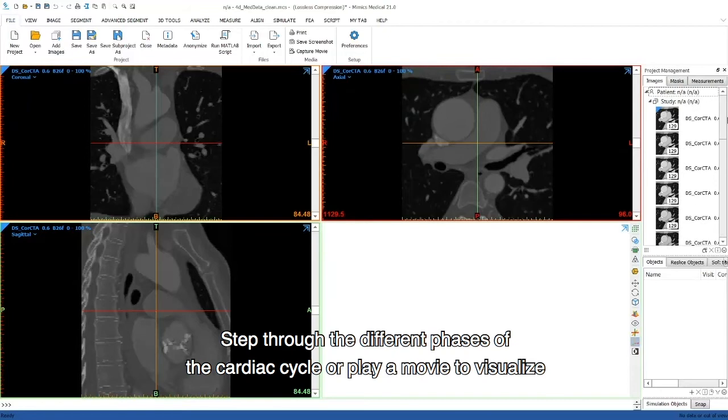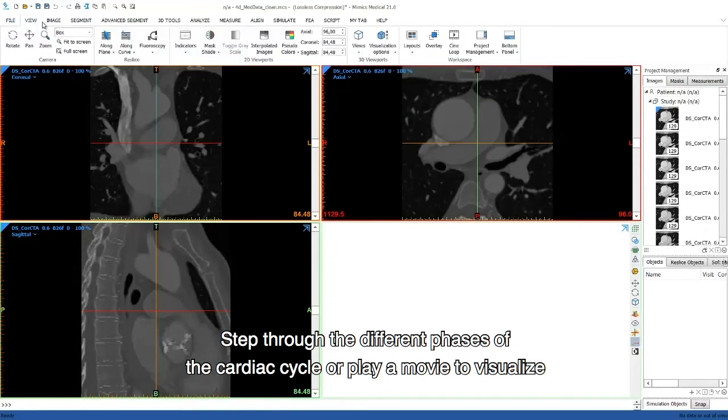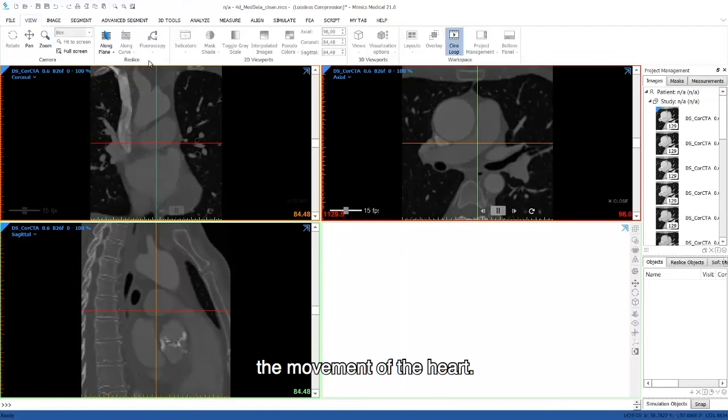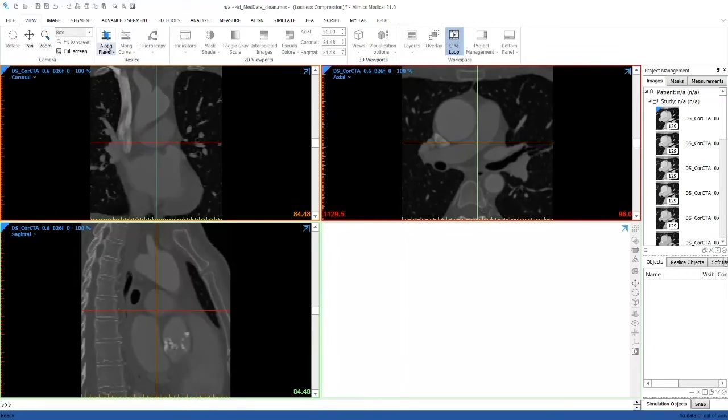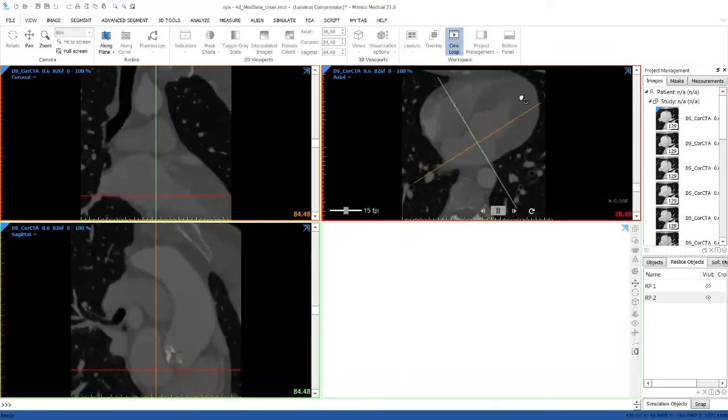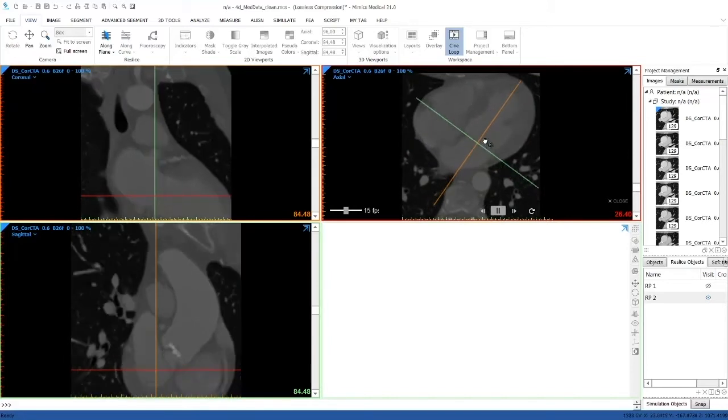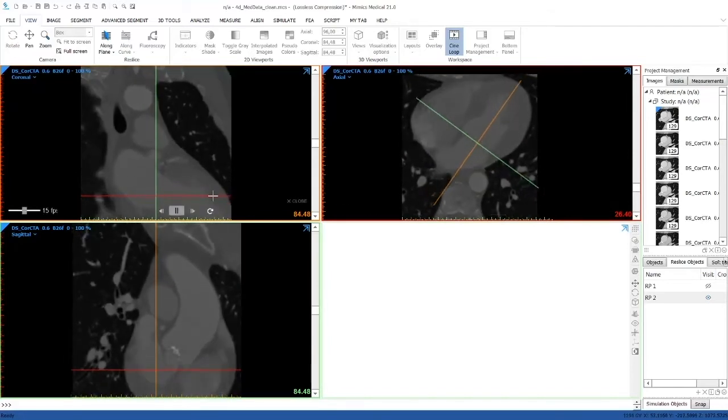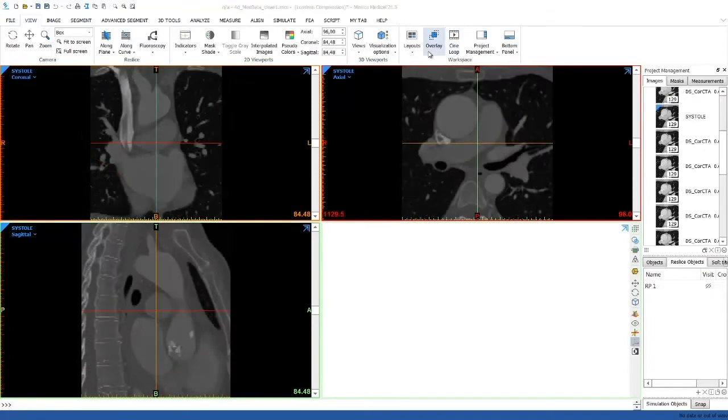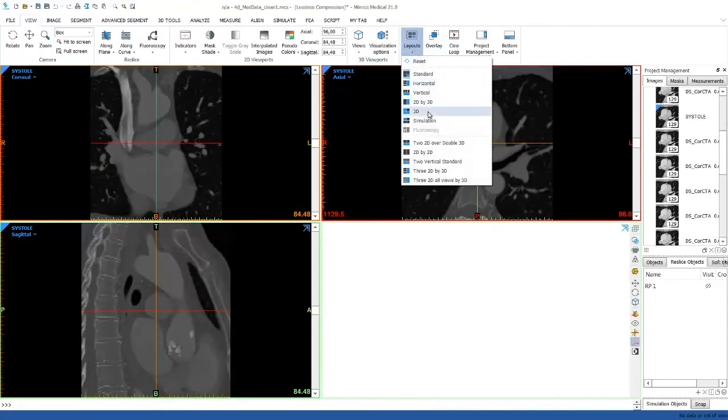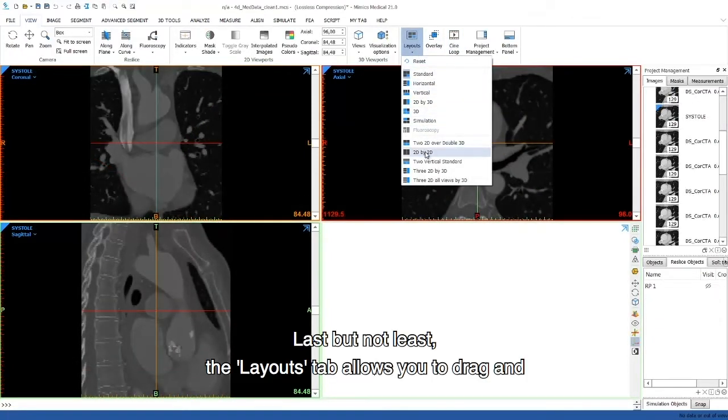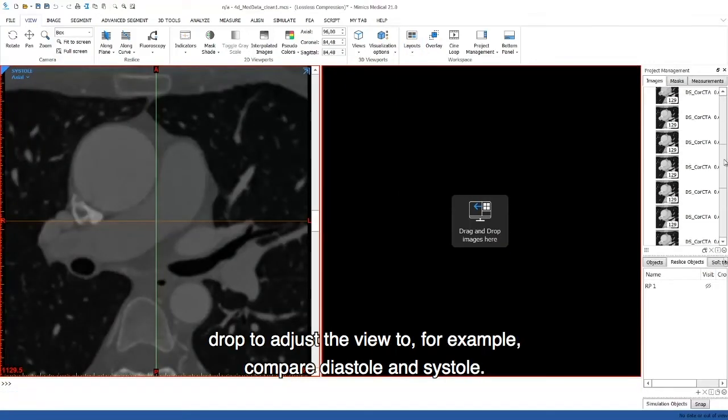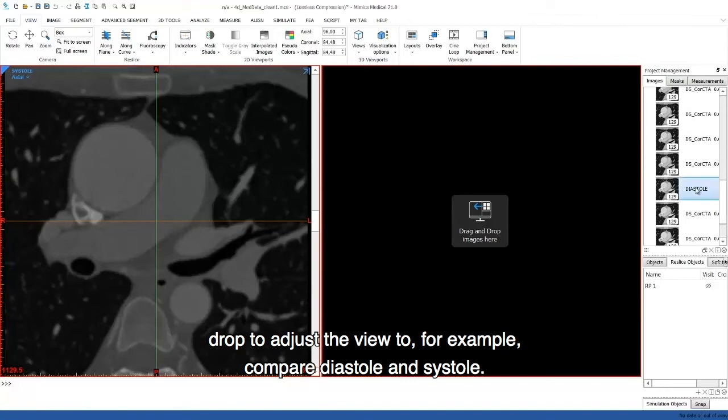Step through the different phases of the cardiac cycle or play a movie to visualize the movement of the heart. Last but not least, the layout step allows you to drag and drop to adjust the view to, for example, compare diastole and systole.